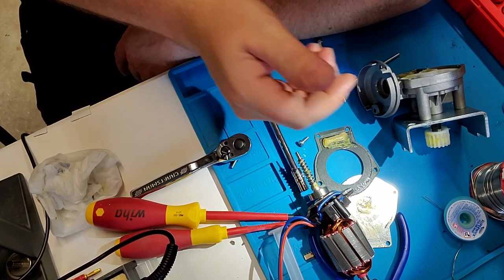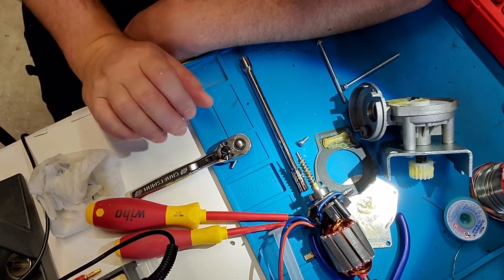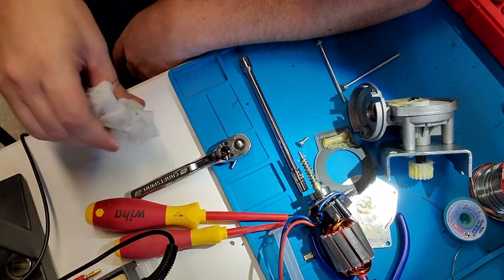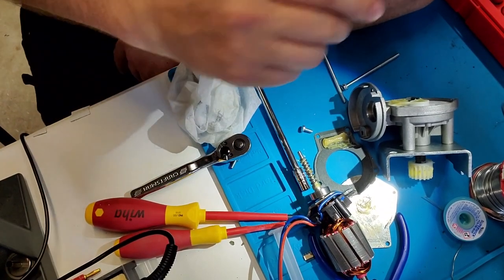That was it. Two teardowns. I got a motor and a CPU out of a Medivator scope washer. Both units appear to be good, or at least they're salvageable parts. So you don't just have to throw stuff away. We try to find another use for it somewhere further down the road.